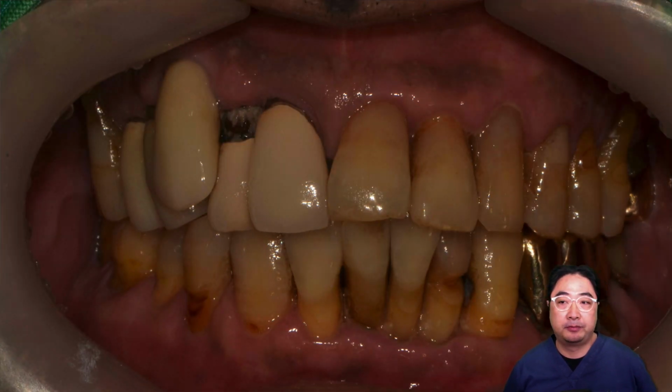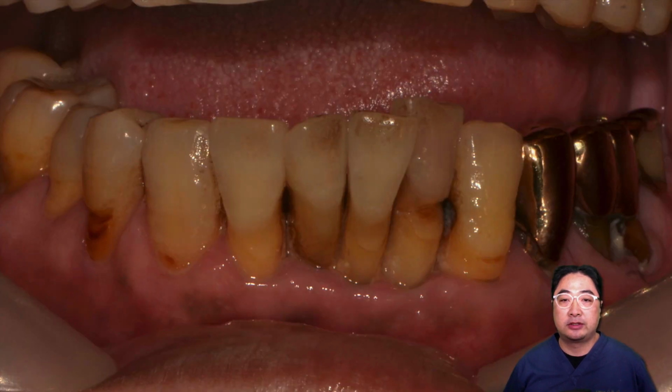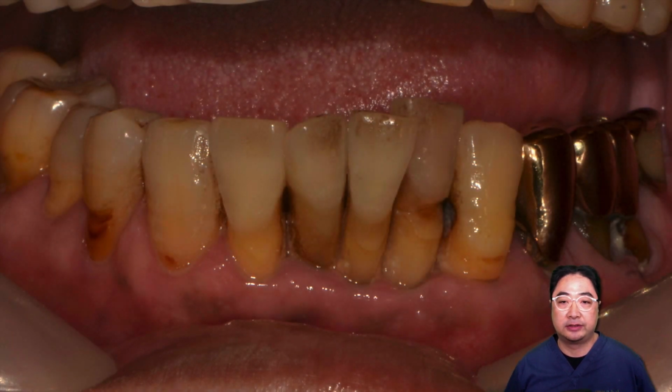Okay, so from the clinical picture you will notice that this patient has very bad oral hygiene and many teeth have to be treated, but I want to focus on these lower anteriors. These three teeth here are very mobile. So I'm going to extract these three teeth and I'm going to temporize from this canine to the canine, including this lateral incisor.